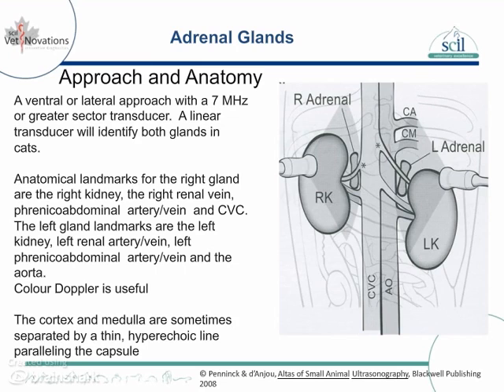In lateral recumbency, the right adrenal is found by placing a probe in the right paralumbar fossa, fanning the beam until the caudal vena cava is located. Don't apply too much pressure to collapse the thin-walled, low-pressure caudal vena cava, though. Use color Doppler to aid in vascular identification. Rock the probe cranially, fanning in a ventral dorsal direction to identify the right renal vein heading to the caudal vena cava. The craniomesenteric artery and celiac artery may also be seen just cranial.